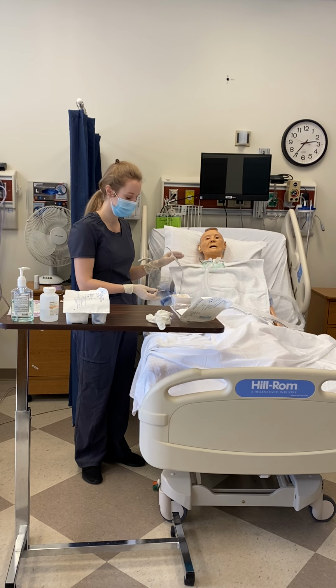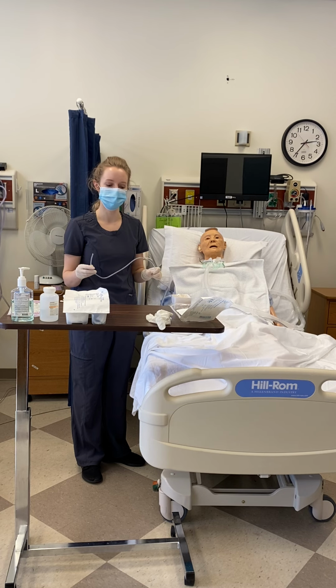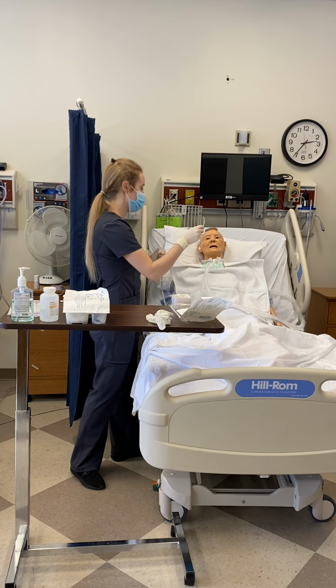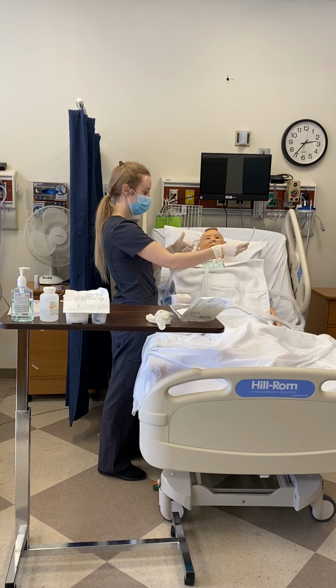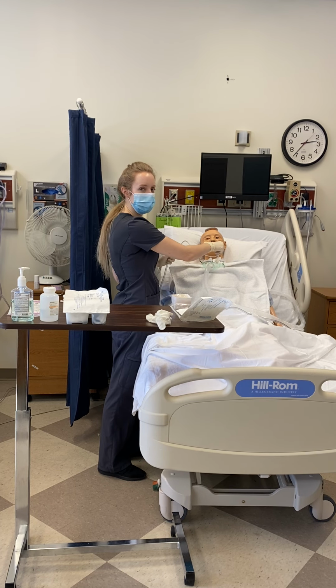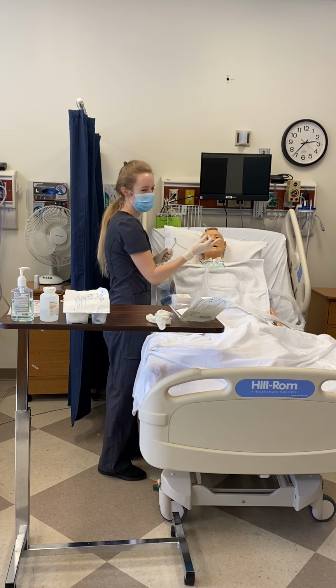Once he's hyperoxygenated, we have established he can raise his right hand if he's experiencing any respiratory distress. I have lubricated my suction catheter, and after testing to make sure my suctioning works, I enter about 10 to 15 centimeters until my client coughs or until I meet resistance. And then I pull back 1 to 2 centimeters before applying suction to not damage the mucous membranes of the bifurcation. Rotating slightly, providing intermittent suction, about 10 seconds.